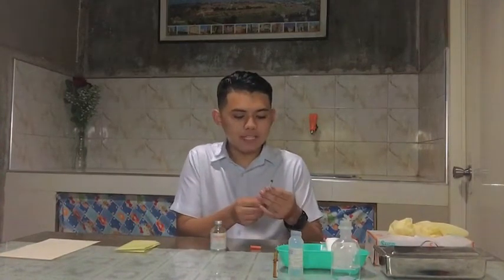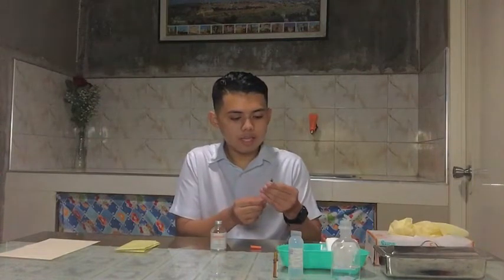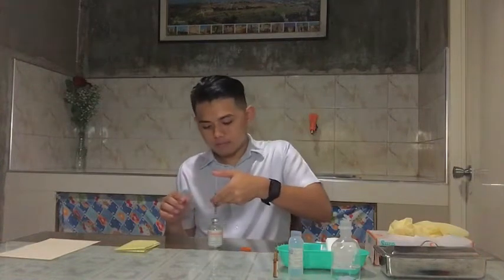So for example, we will be needing 50 units. So here, let's have some air. Then inject the air into the vial, keeping the bevel of the needle above the surface of the medication. So here, withdraw the prescribed amount of medication and hold the vial down with the base lower than the top. Then move the needle tip so that it is below the fluid level and withdraw the medication.